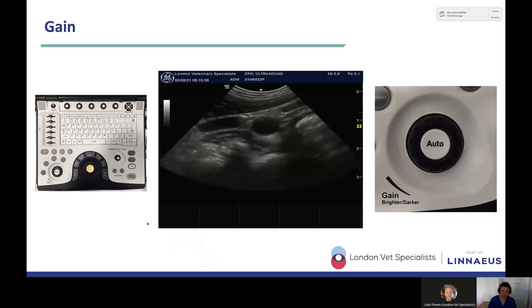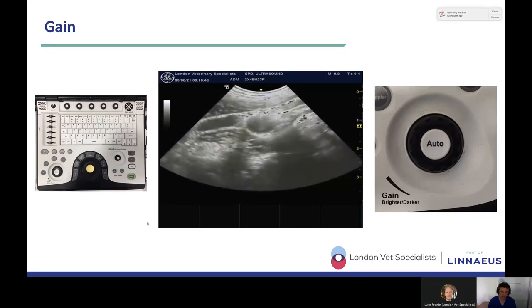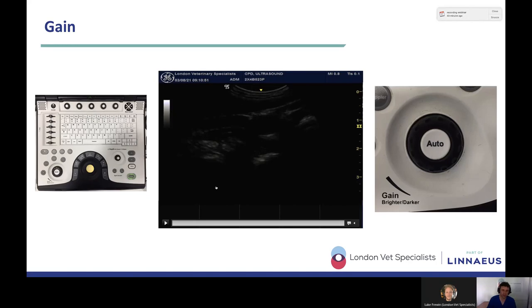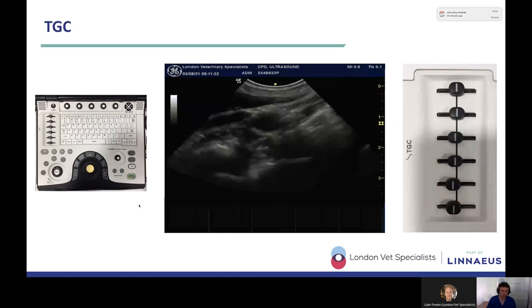So this is our image as it starts. This is me turning the gain up. So all of our sector is getting bright, and then we're going to turn the gain down, and all of our sector is getting dark. So that's what happens when you alter the overall gain. All of it gets bright, all of it gets dark, depending on what you're trying to achieve.